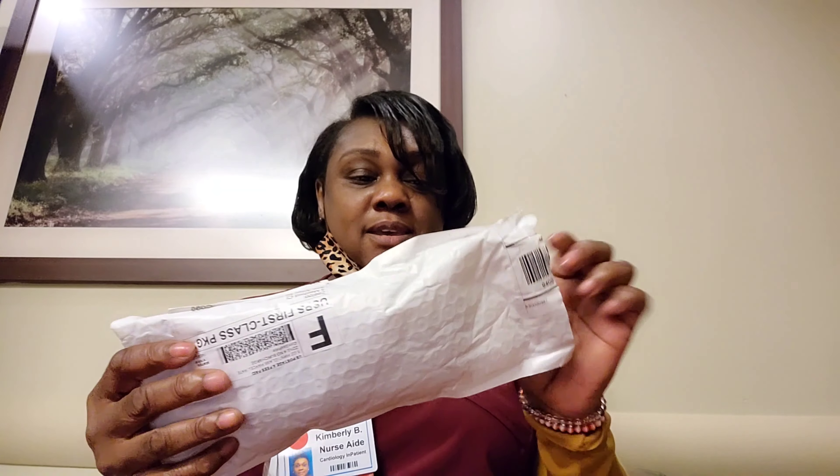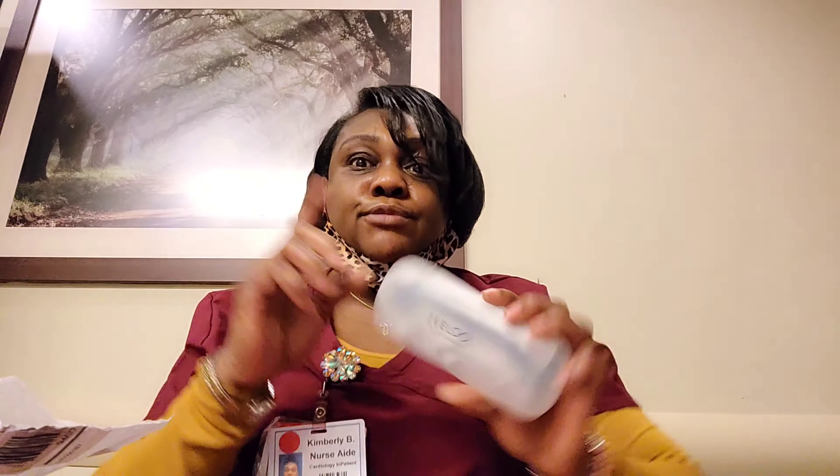I'll just do a really quick video while I'm at work. They come in the packaging like this, and they come in a container like this that says Zilu — a really hard, sturdy container. Really good. I really like these containers. They really keep your glasses safe.